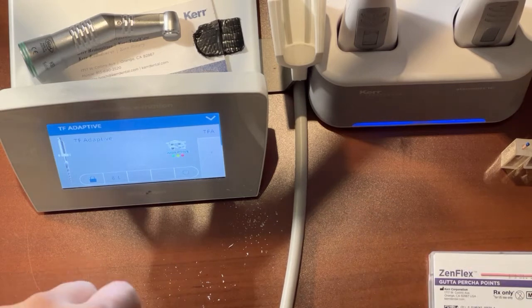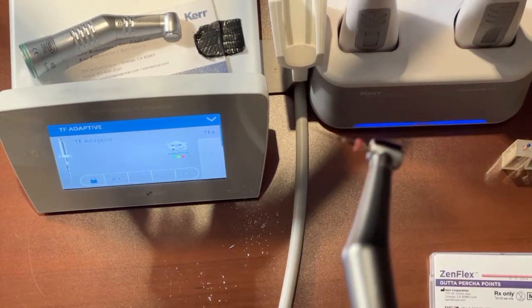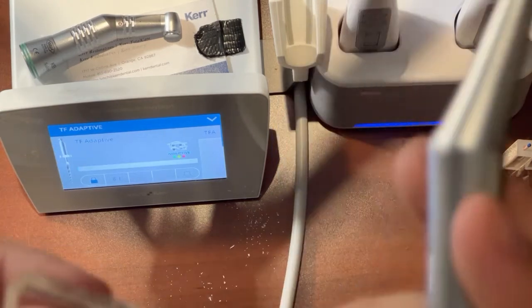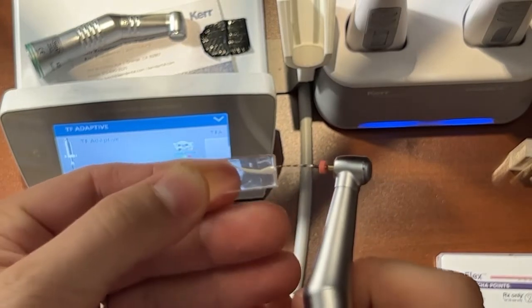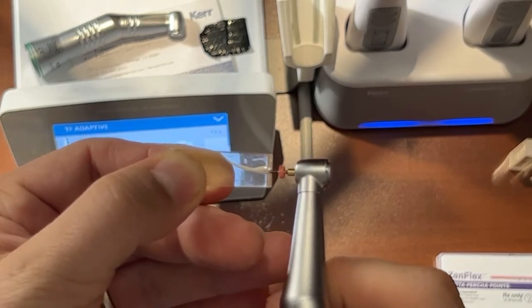Perfect. So now we have done our orifice opener step, we have done our glide path, and now we will go and shape it the rest of the way. So now we're going to take our 2506 file and start to shape that canal. We're just going 1 to 2 millimeters at a time.